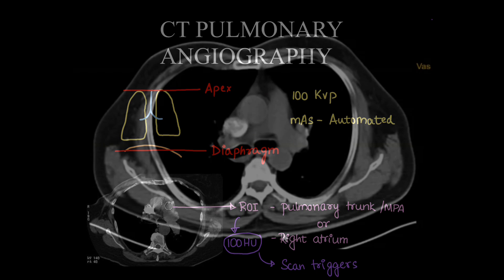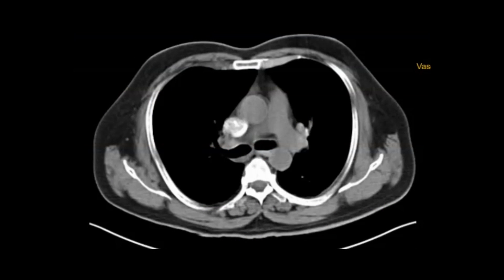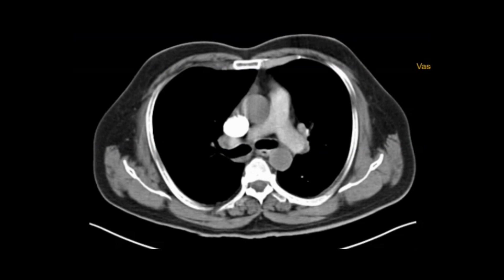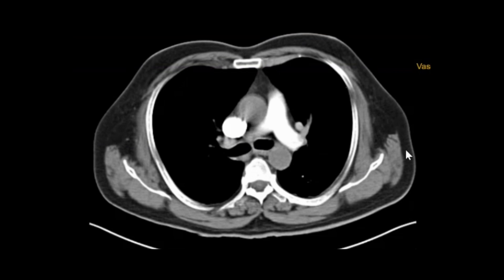Here we can see: once the scan starts, the superior vena cava starts filling up with contrast and the pulmonary vessels start showing contrast. Now the contrast is entering the pulmonary arteries and the superior vena cava has contrast. The ROI is to be placed in the main pulmonary artery.